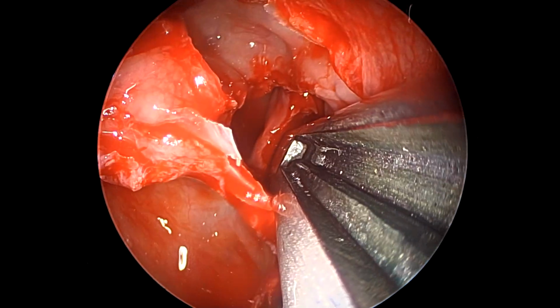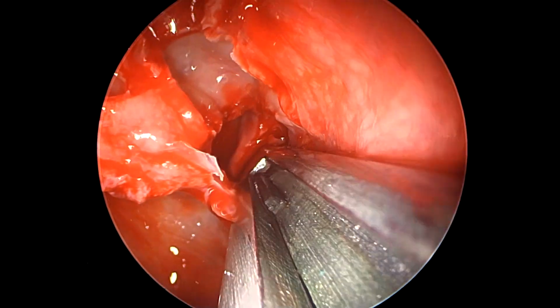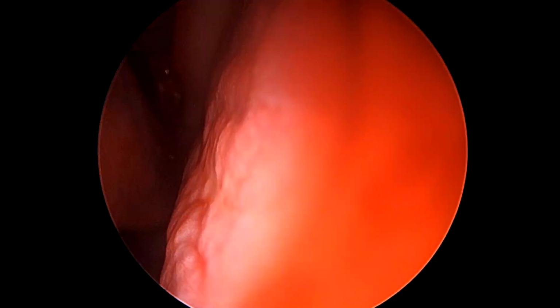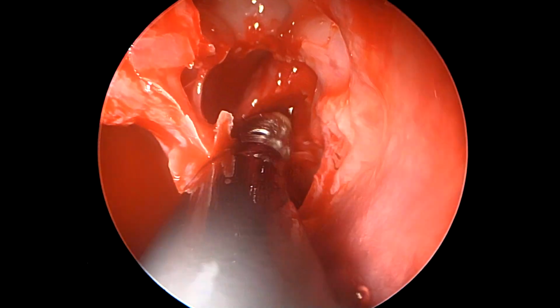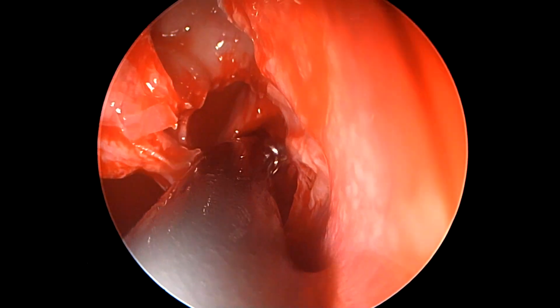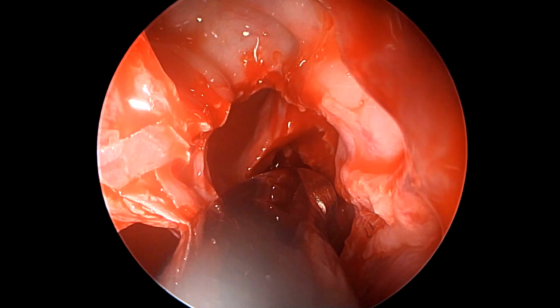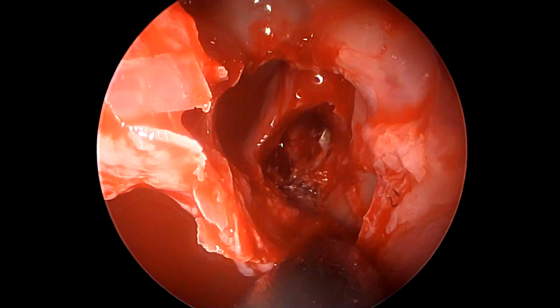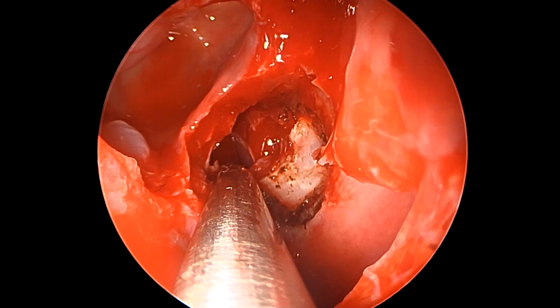Now we are using a Hajek-Kofler punch to remove some more bone inferiorly to come inside the sphenoid sinus. As we see here, a small vessel inside the sphenoid sinus as we are opening it, most likely the septal branch of the sphenopalatine artery that supplies the nasal septum, can sometimes get traumatized. Here we're using a standard ProSize Max coagulator wand to coagulate the bleeding vessel for us to have a clear vision. One can also use endoscopic bipolar forceps.